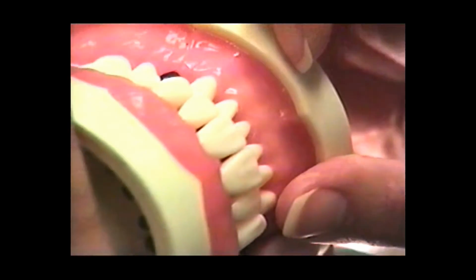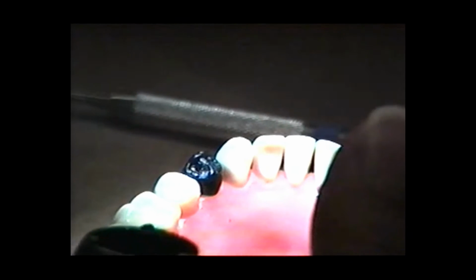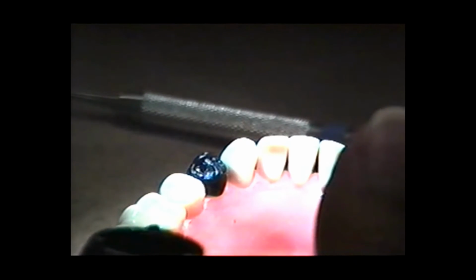So I'm just adding a little bit more here on the cusp tip. I'll have to carve it back a little bit, but we want to get some occlusion. So I'm going to close it together until I get that little dent on the occlusal surface that I want on the cusp tip, and it's right there. I might need to add now just to fill in so that when I carve back for my occlusal anatomy, I've got enough wax for what I want to do. So let's do that real quick.